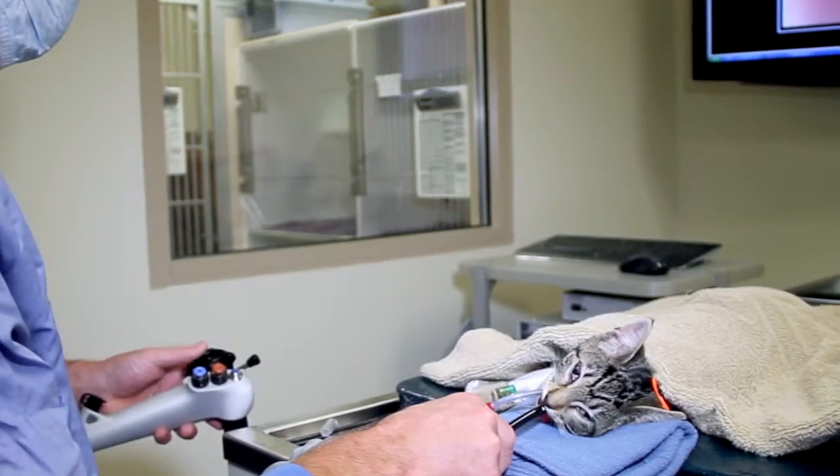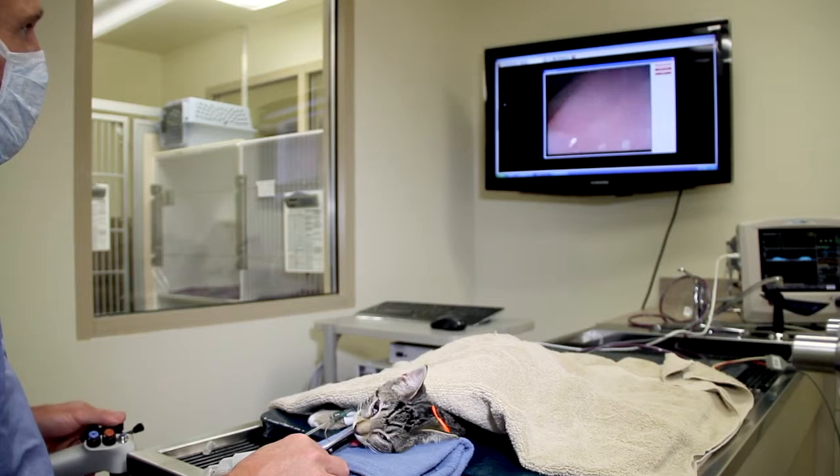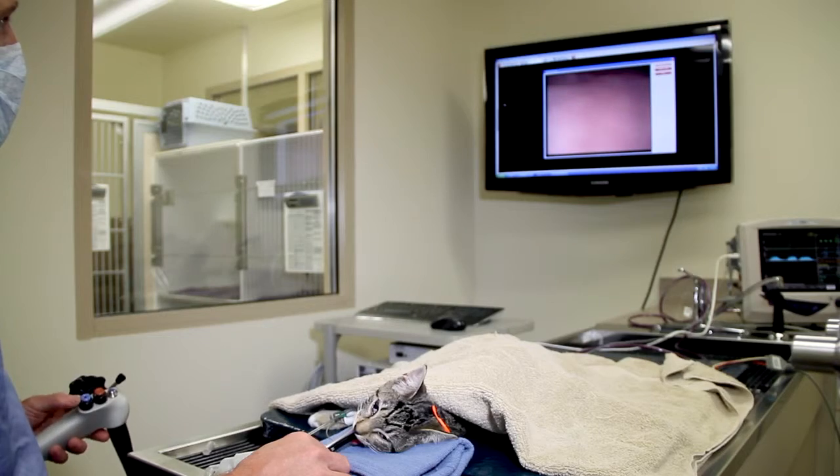The same thing holds true for cystoscopy, which is scopes of the urinary bladder. We can put a scope into the urinary bladder and get a diagnosis. We can see if there's a bladder stone or a bladder tumor. We can get biopsies to confirm that. But we can also resolve the problem. A lot of those stones can be removed with the scope. You can grab the stones and remove them, or flush them out with the assistance of the scope. So that's a therapeutic tool as well as a diagnostic tool.